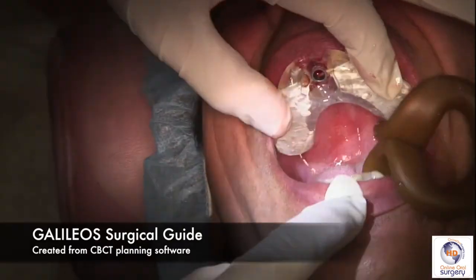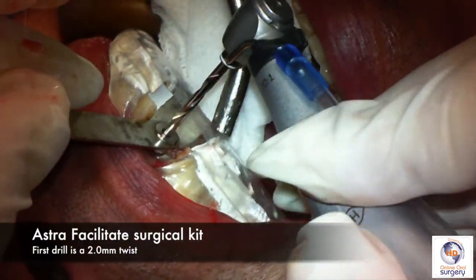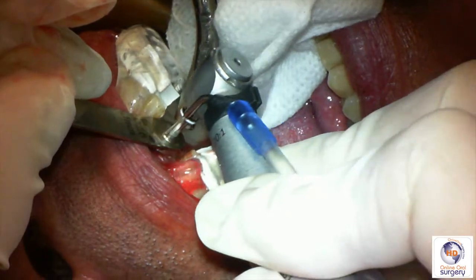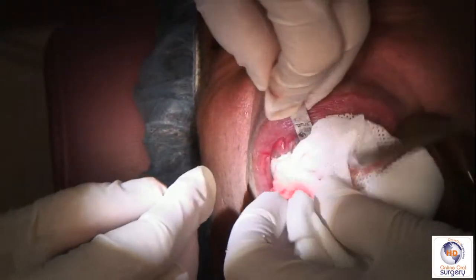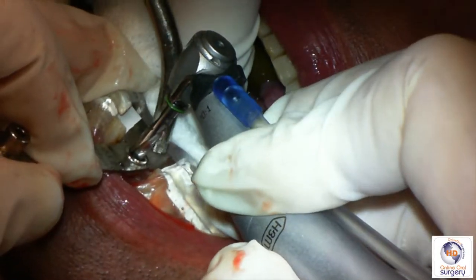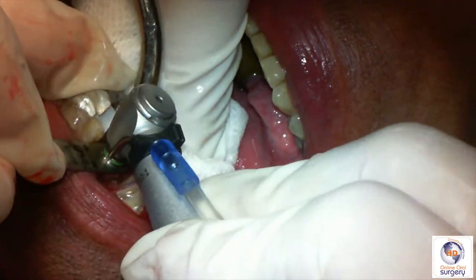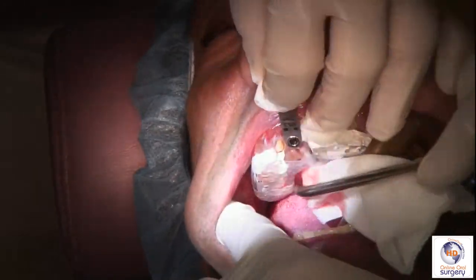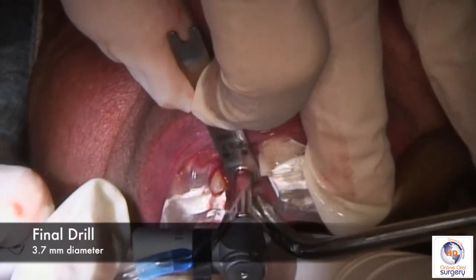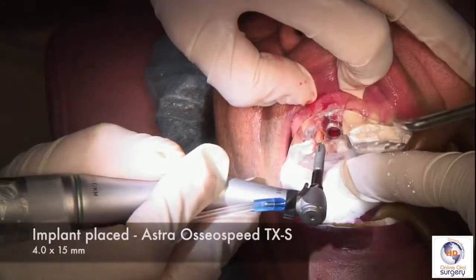Now that the tooth is out, we're going to place our surgical guide, a mouth prop to help the patient keep his jaw open, and a throat pack behind the surgical guide to catch any water and debris. We're going to start with our first drill — this is a 2.0 twist drill. We're using an Astra Osseospeed TXS implant: a straight-walled implant that's 4 millimeters in diameter and 15 millimeters in length. The first key reduces the diameter of the cylinder to 2.0 millimeters for the first drill and also has a depth stop. We then switch to the second osteotomy with a 2.7 millimeter key, using a very light, gentle pumping in and out action, going slightly deeper each time until we reach the depth stop. Then we switch to our final osteotomy, which is a 3.7 millimeter diameter — light pumping in and out action for a 3.7 millimeter osteotomy for a 4 millimeter diameter implant.